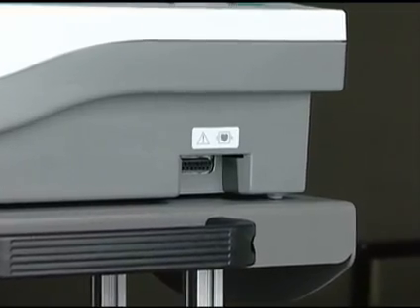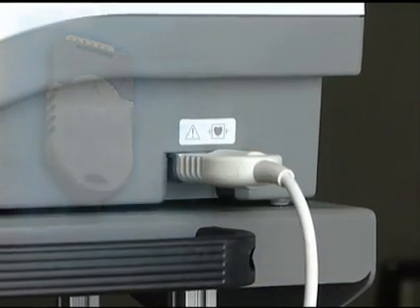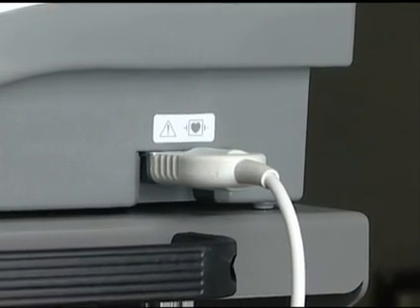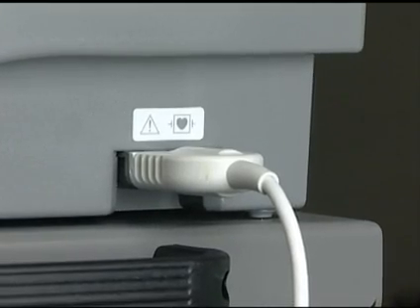To connect the patient cable, hold the cable head with the arrow facing up, apply pressure, and push the head into the lower right port. Don't pull or push on the cable itself.